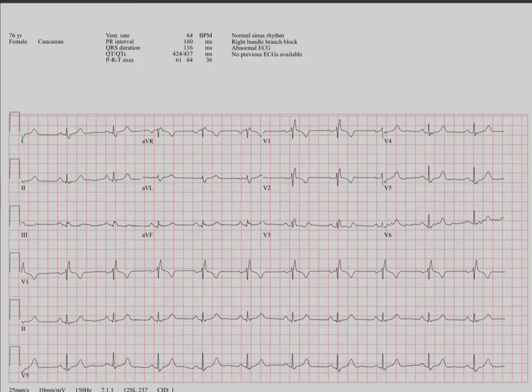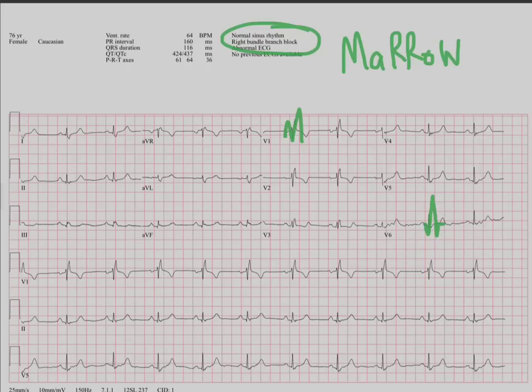Okay, next one. All right, here, hey, look at that. That looks like an M. Definitely looks like an M. So we have marrow. And it kind of does. It goes down first, then up, then down like that. So it's hard to see, but it kind of looks like that. So we have a right bundle branch block.